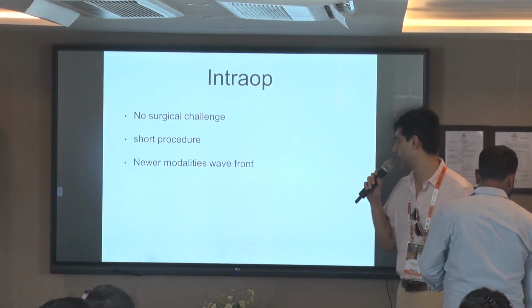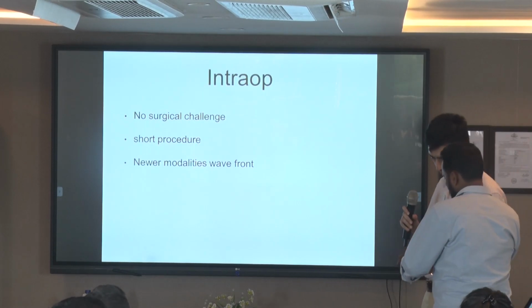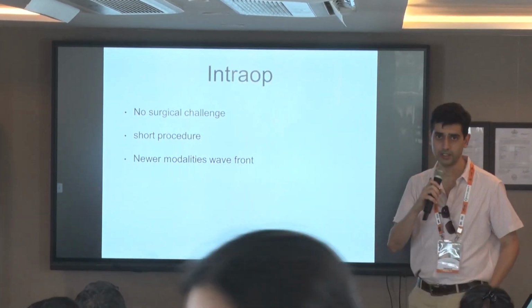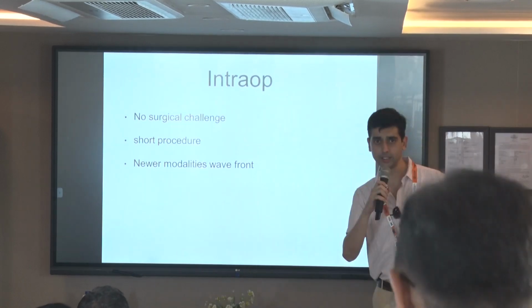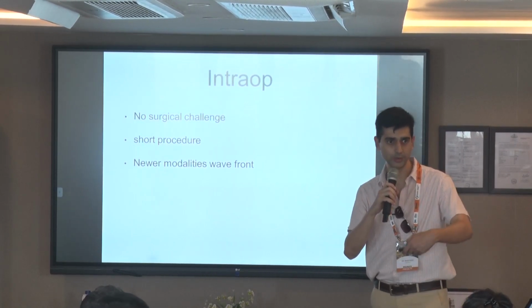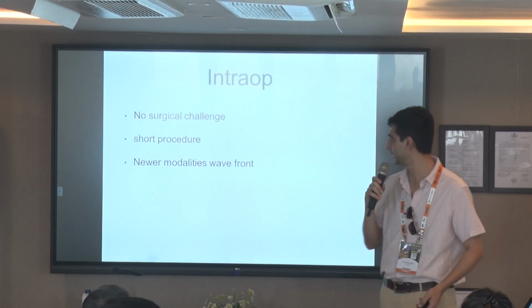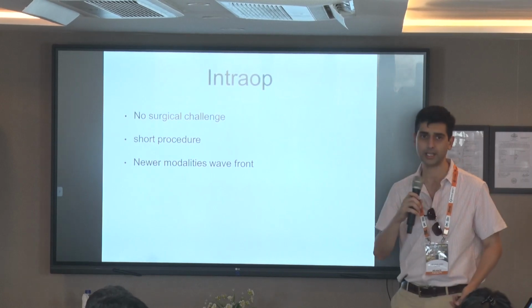And intra-op, everyone knows that. So intra-op, we all know that a surface ablation is almost a no-brainer, given the fact that our retinal colleagues tell us that when your surgery ends, our surgery begins. So they do a scraping and then their surgery begins. And when we do a scraping, our surgery ends. A procedure cannot be more short than a surface ablation.